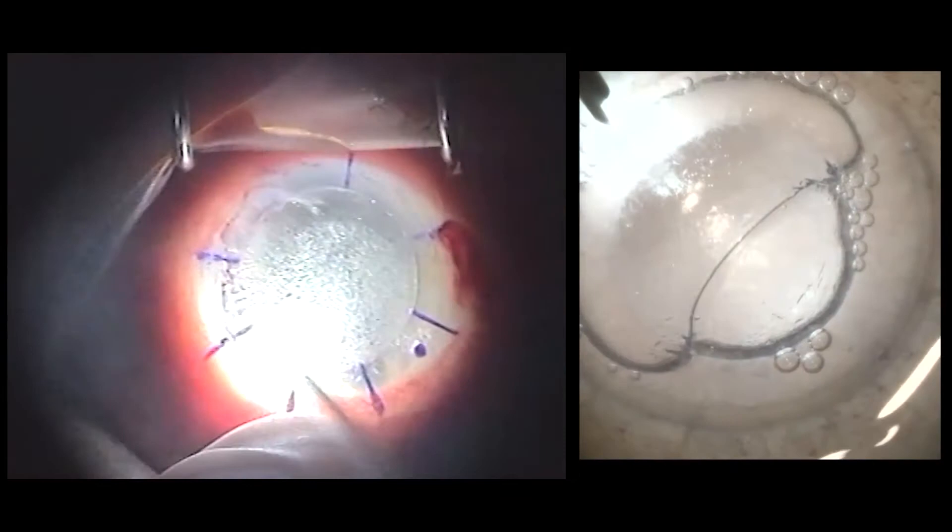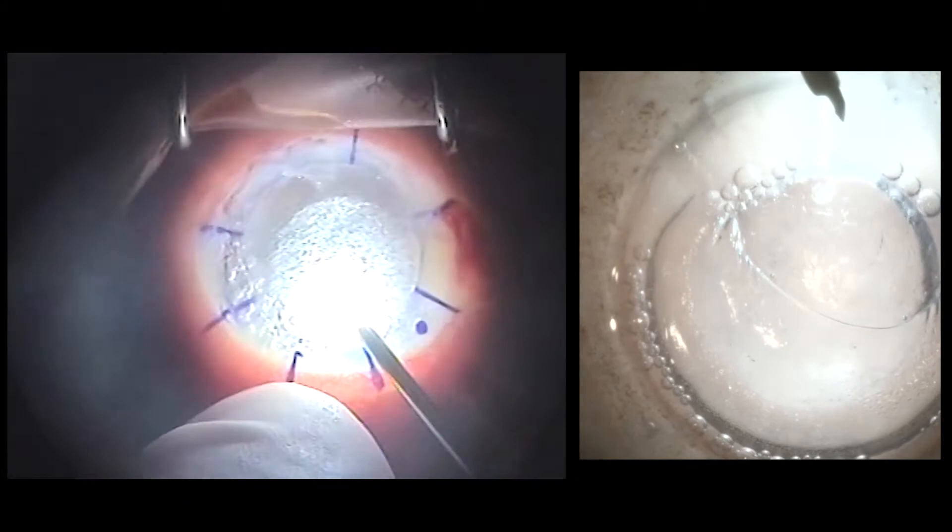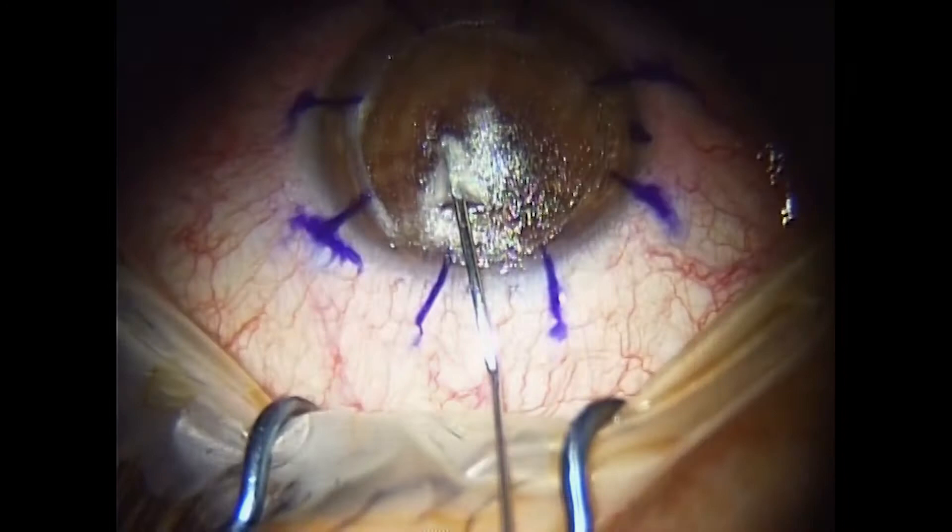This is a very useful and cost-effective technique. It really helps you identify the big bubble to avoid excessive injections and it really facilitates the surgery flow. It is also important and useful to transilluminate regularly during the surgery to assure the presence of the bubble, its size and its location.